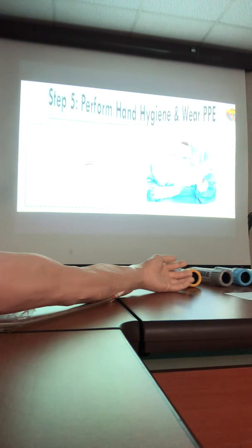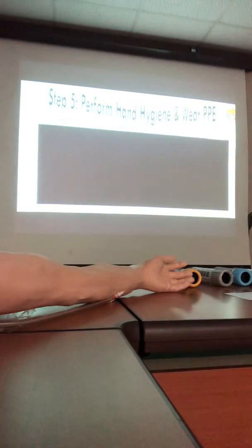Perform hand hygiene and wear PPE. I think everybody knows the ideal way for hand hygiene and the PPE.